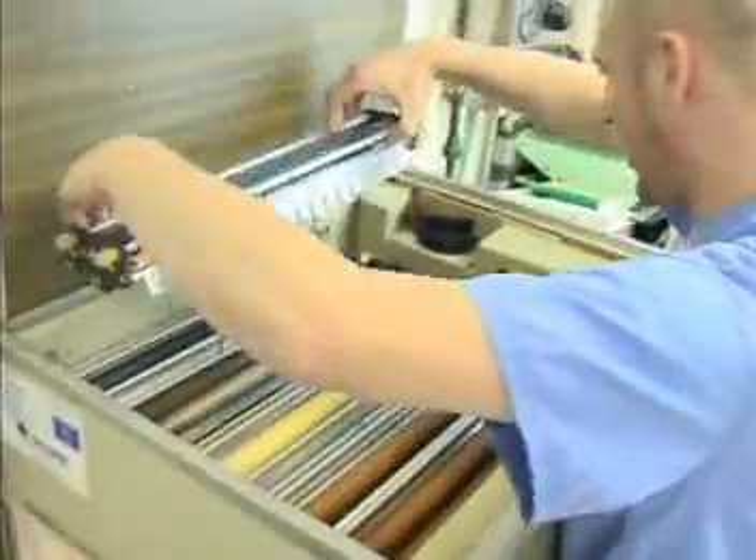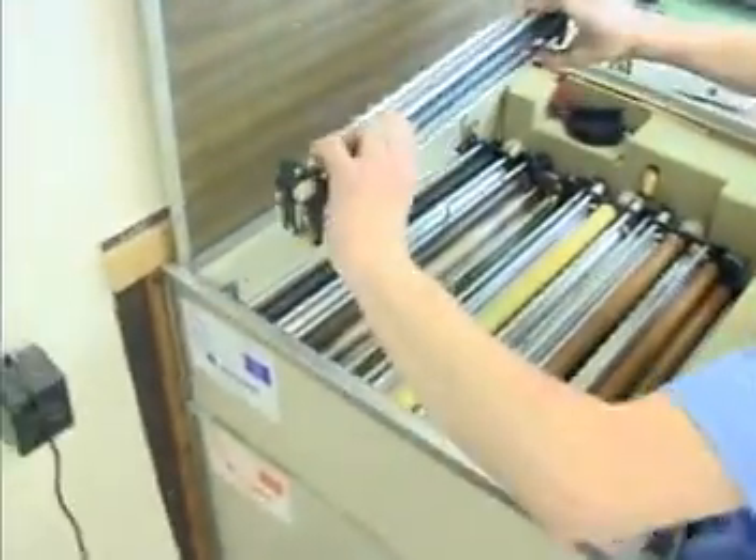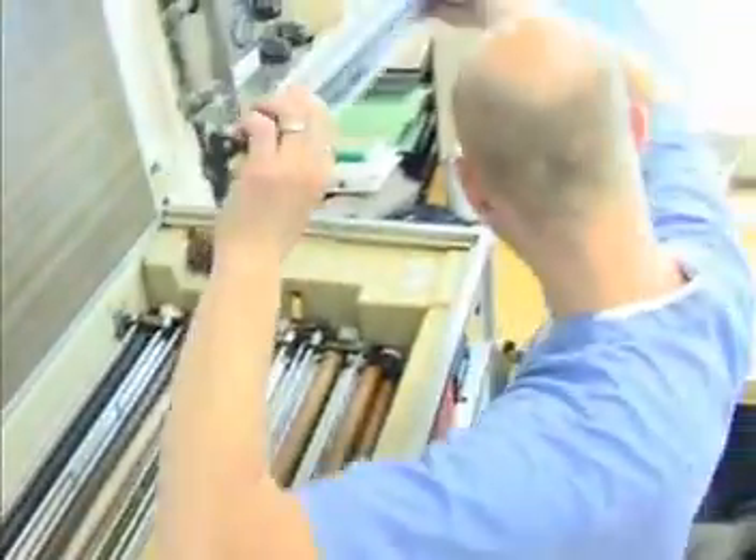I'm going to take these out. I don't want to mix the fixer and developer, or the whole thing will have to be flushed and redone. The patient's going to have to be re-exposed for no good reason.